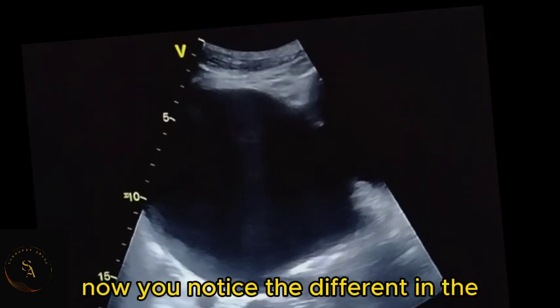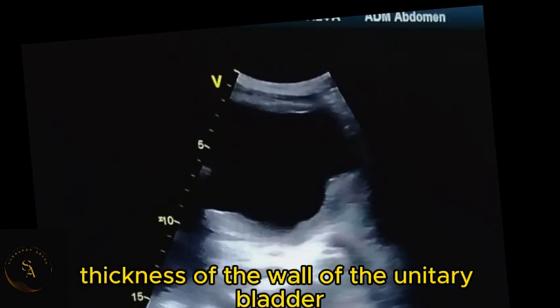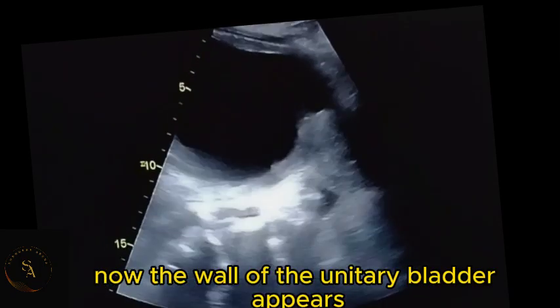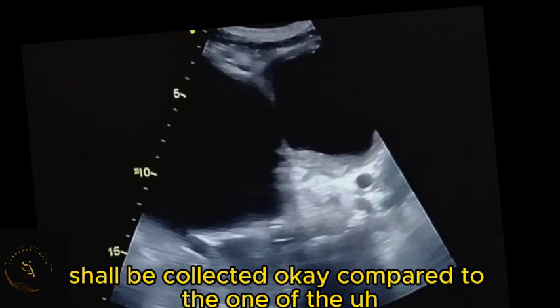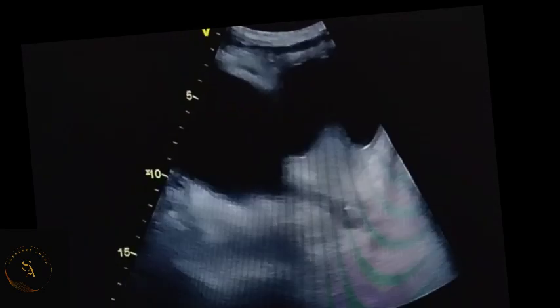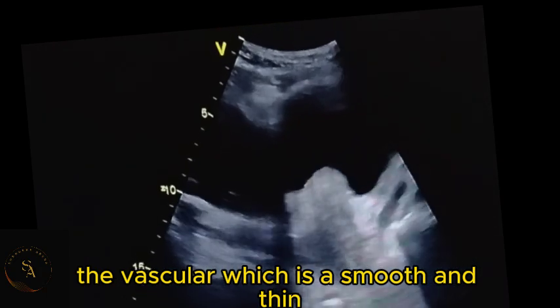Now, you notice the difference in the thickness of the wall of the urinary bladder and that of the diverticulum. The wall of the urinary bladder appears trabeculated, compared to the wall of the diverticulum, which is smooth and thin.